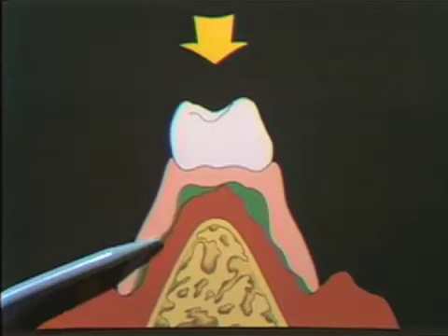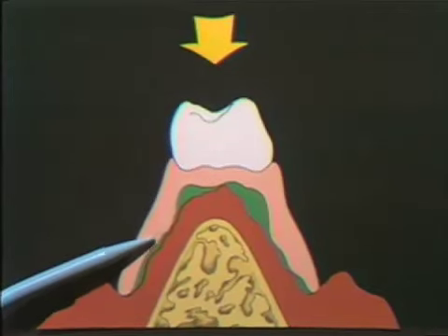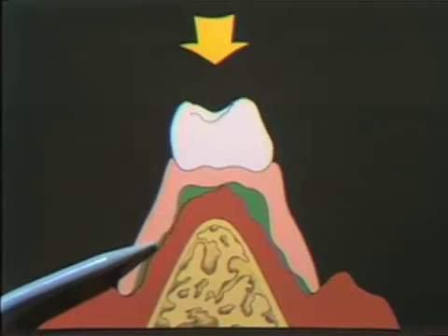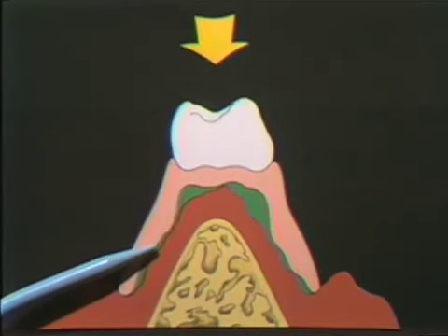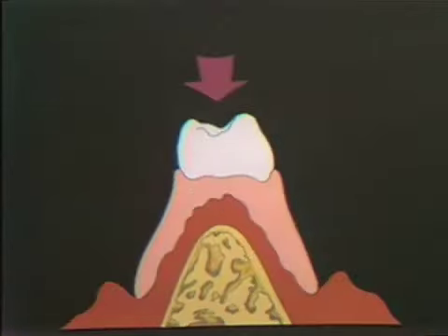This movement makes it difficult to design a stable occlusion. It is also difficult to attach this base to the abutment teeth because of this movement. The rest position of the tissue can be relatively stable. There can be many so-called functional positions of the tissue, depending on the form of the tissue during the time of the impression, the force, and the rigidity of the impression material.